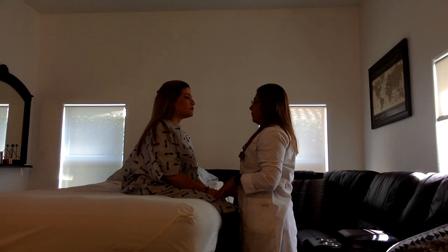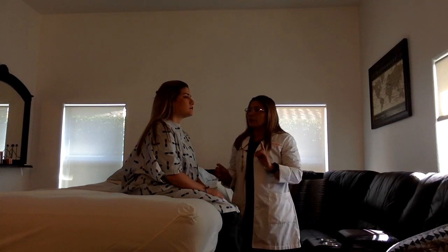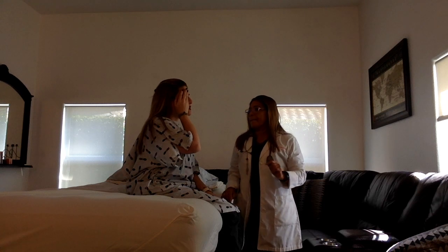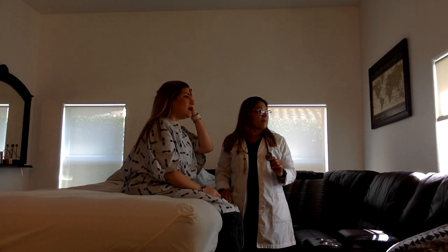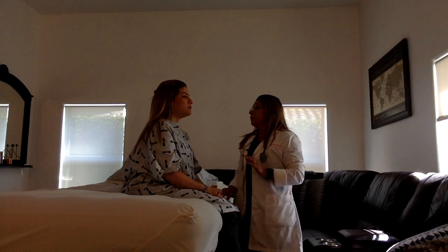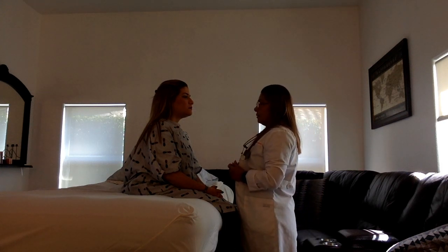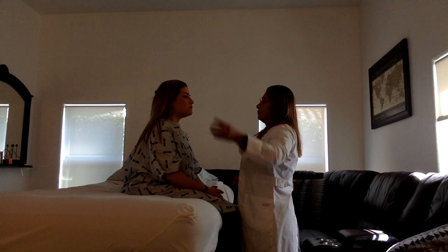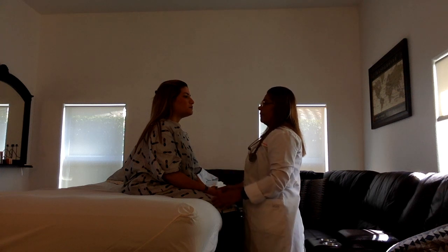Okay, Miss Guerra. Now we're going to do the visual acuity. Behind me is this Snellen chart, about 20 feet away. I'm going to ask you to cover one of your eyes and read the letters. D E F P. Okay. Now let's do the other eye. D E F P. Okay. Now with both eyes. D E F P. Okay, it's perfect. Now we're going to do something called confrontation. I'm going to be moving my fingers, and you're going to let me know when you see them. Do you see them? Yes. Do you see them? Yes. Okay, perfect. You're doing great.